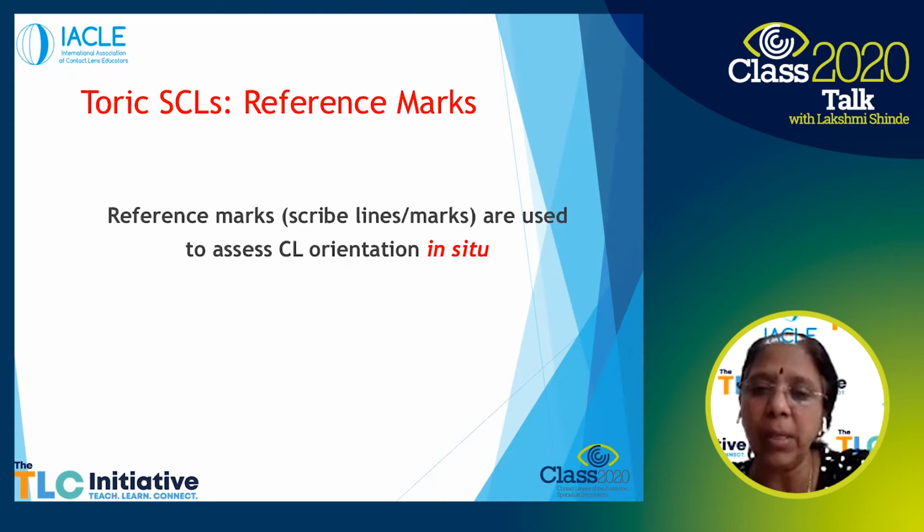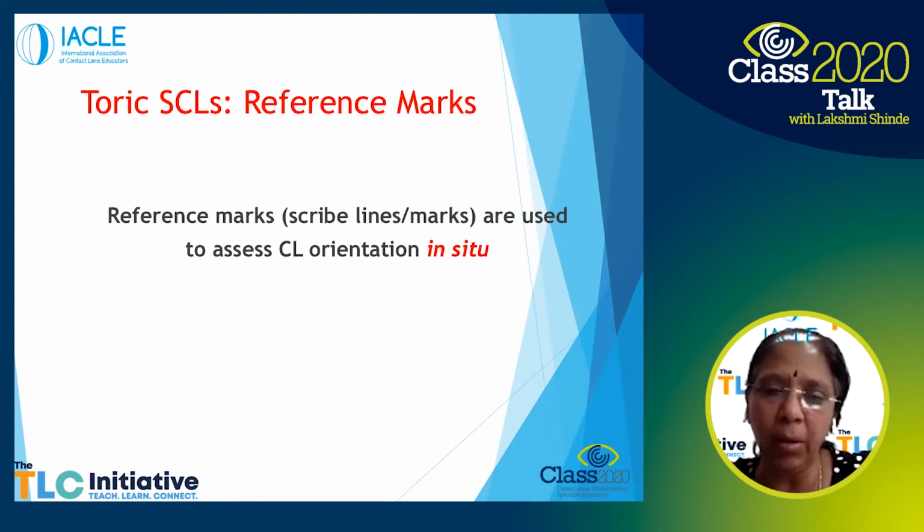It's a marriage of many factors, Nilesh. Whether the lens is high water content or low water content, against your stabilization technique, all of that together is aimed at just one thing, that the lens stays stable on the eye. And practically, if you fit 100 soft toric lenses, as a practitioner I would have seen at most maybe around 5 to 6 which really rotate.